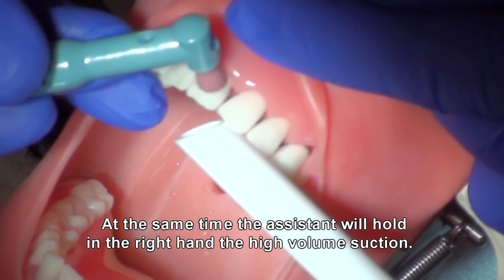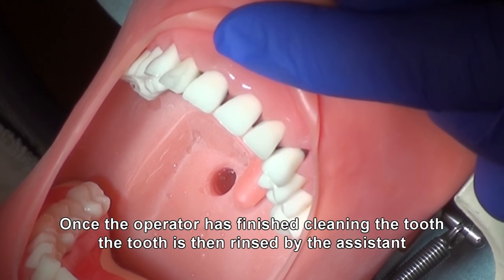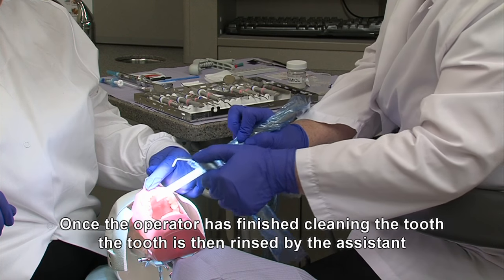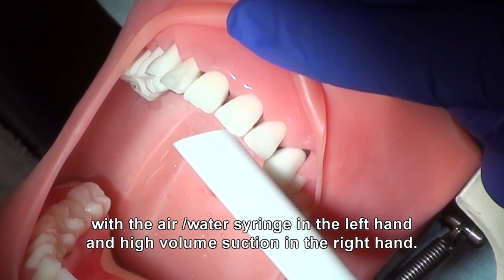At the same time, the assistant will hold in the right hand the high volume suction. Once the operator has finished cleaning, the tooth is then rinsed by the assistant with the air water syringe in the left hand and the high volume suction in the right hand.